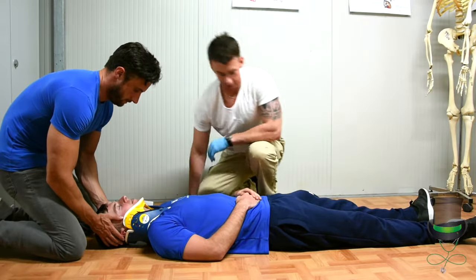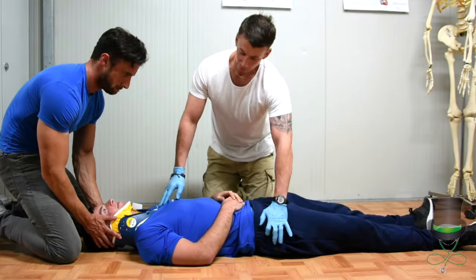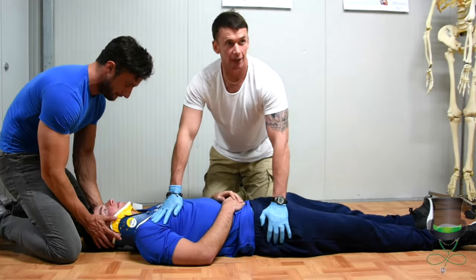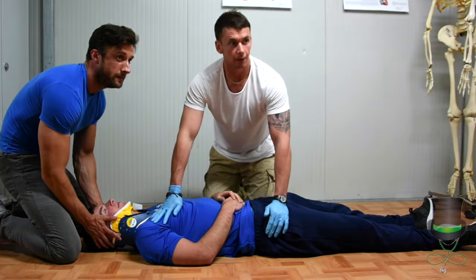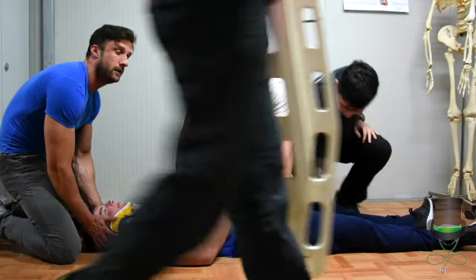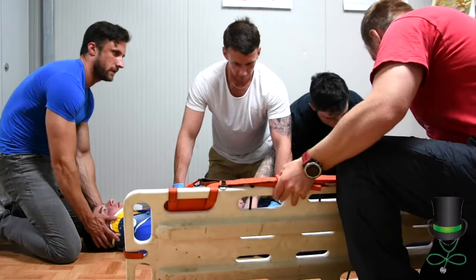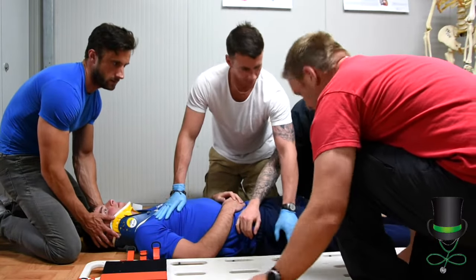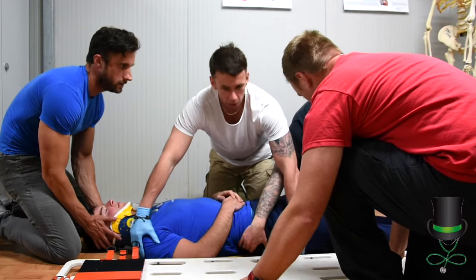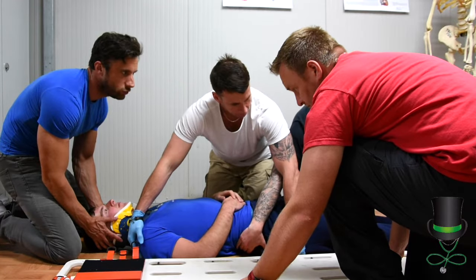Once the collar is in place, we're now ready to roll the patient onto a spinal board and we may need additional pre-hospital providers. The guy at the head will always control the movement of the patient. Prepare to roll, and roll.